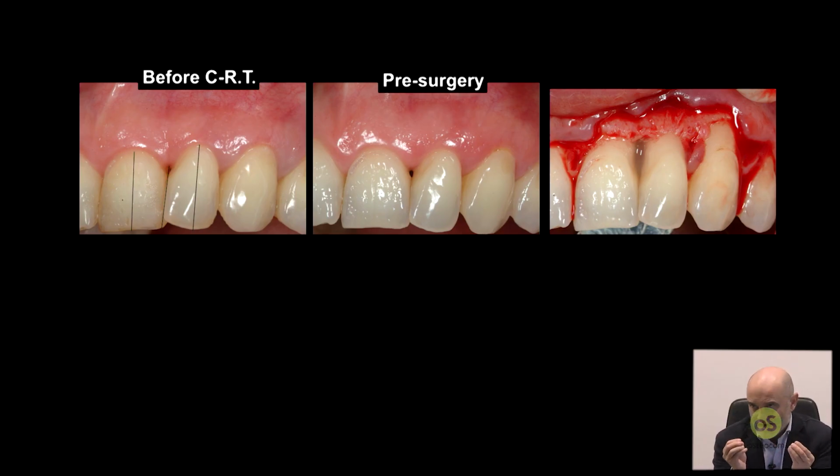Once the gel has deposited the protein, the gel must go away, because the cells capable, once they get in contact with the amelogenins, of being transformed into cementoblasts, fibroblasts, and osteoblasts are not contained in the gel, but are in the blood clot.